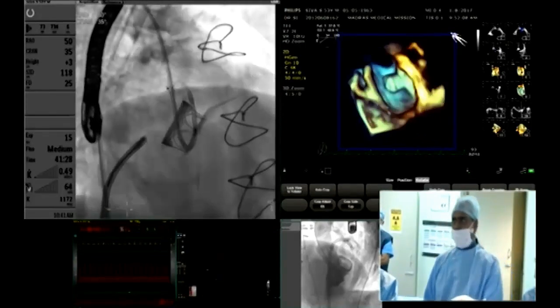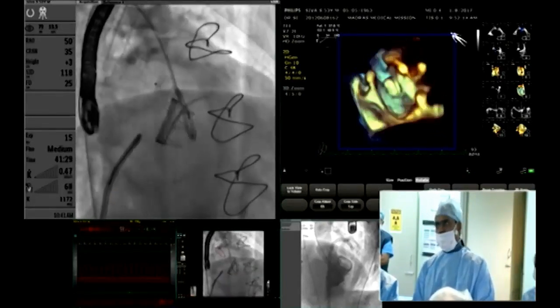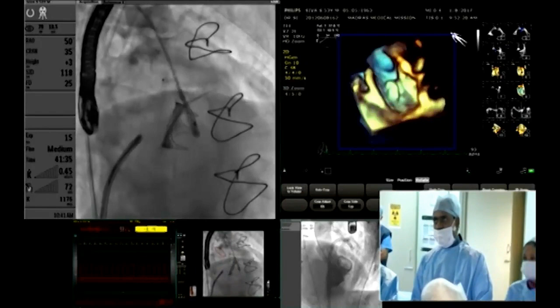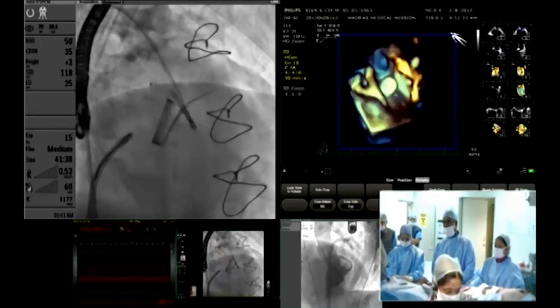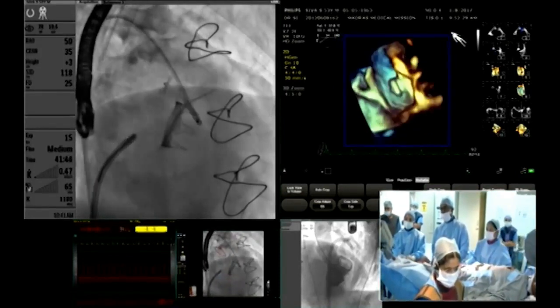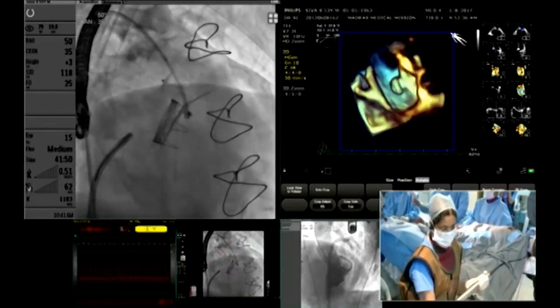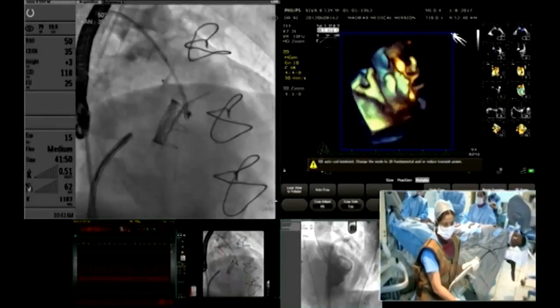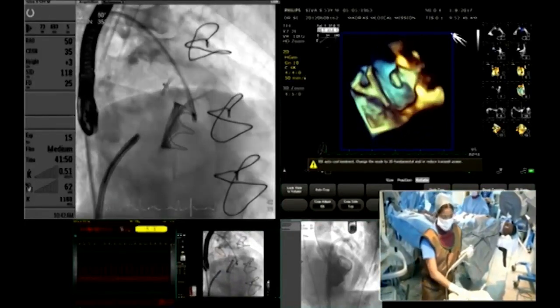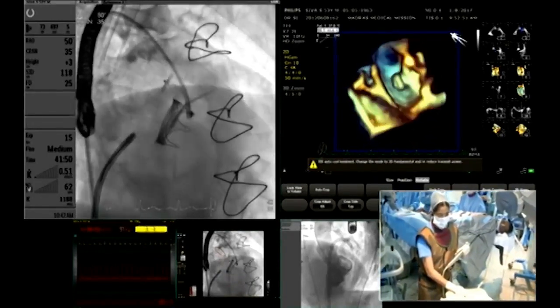The position here seems okay to me. That looks fine. You have to take it into the tract — I am slightly coming out. Now the entire device has been deployed. Sreeja is showing a beautiful position of the left atrial disc protruding into the left atrium. Turn it, Sreeja, and show the ventricular side.